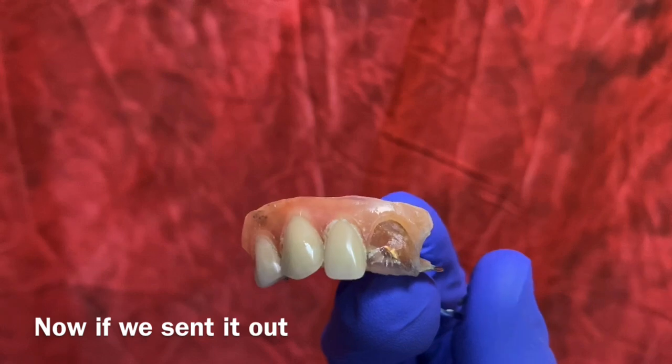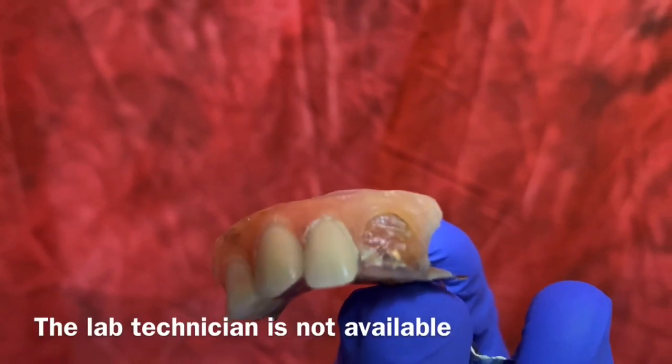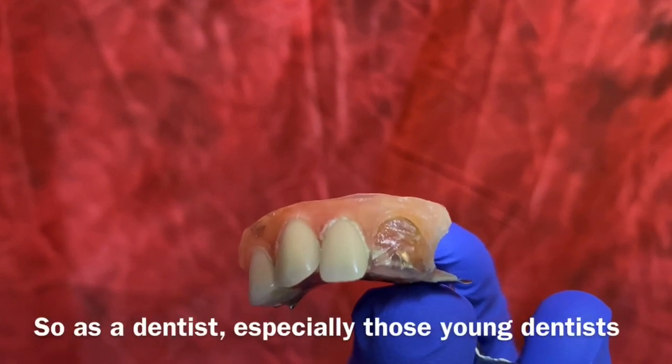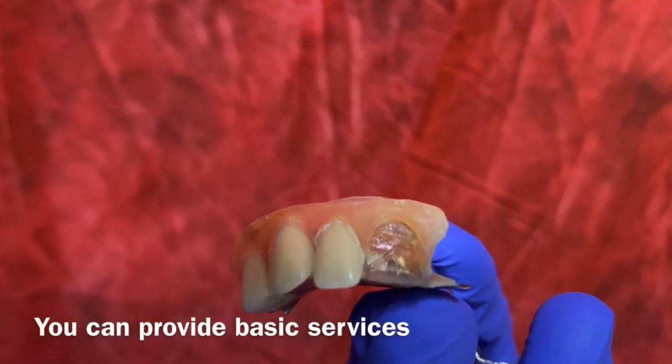Now if we send it out, it will take a long time and the lab technician is not available. So as a dentist, especially young dentists, you can provide this basic service.